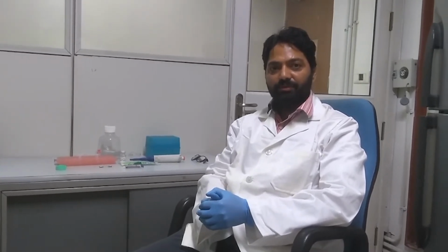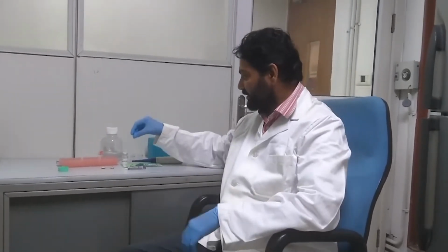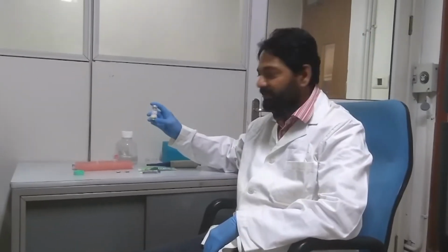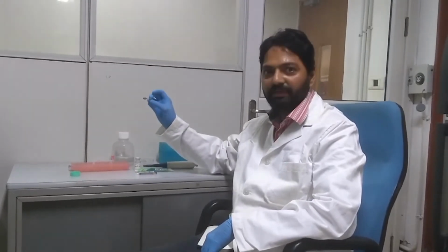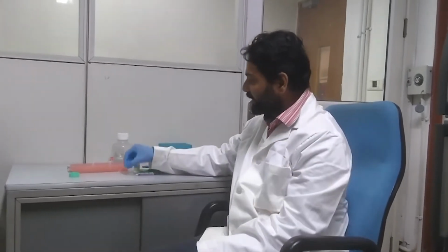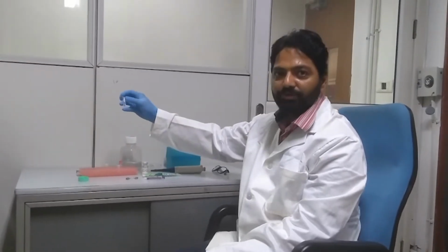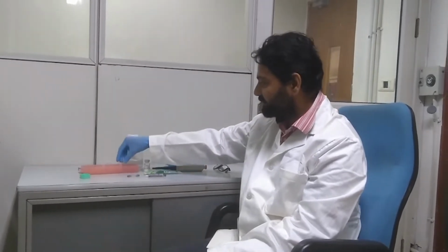I work in CSIR, CDRI. In today's demo, we will be discussing the different steps involved in the generation of antibodies in rabbits. For the first step, we require several things like Freund's complete adjuvant. Here it is, from Sigma. We need a microemulsifying needle, which has two openings connected with a fine needle. We need antigen which is purified and filtered, so there are no contaminations. It is a sterile solution of antigen.